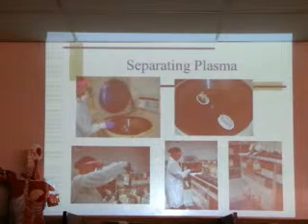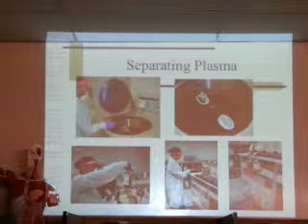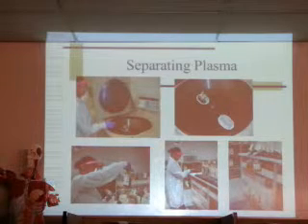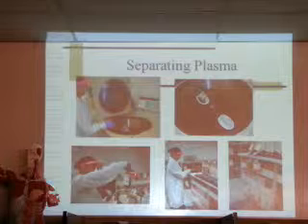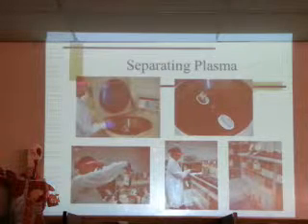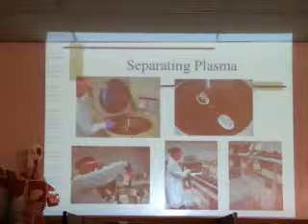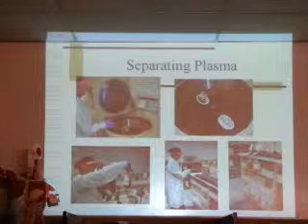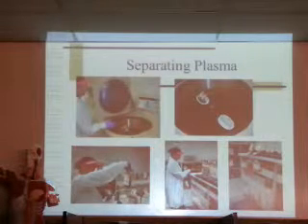And it's a light centrifugal spin. It's done at a lower speed because we want platelet-rich plasma. So here, after it's centrifuged, she takes it out of the cup, and you can see that the plasma is on the top, and the red cells, because they're heavier, are on the bottom. So this is the platelet-rich plasma that is separated into the first satellite bag.